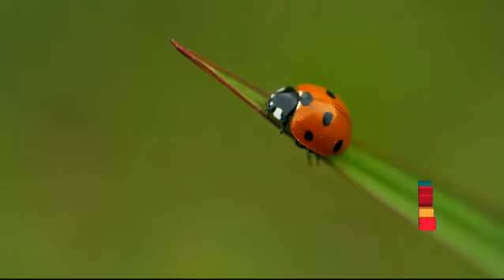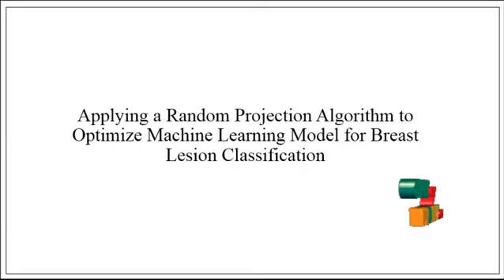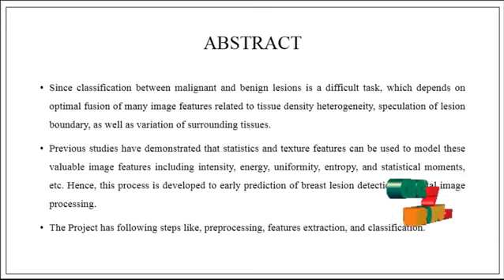Welcome to ClickMyProject.com. Now we are going to discuss the project applying a random projection algorithm to optimize the machine learning model for breast lesion classification. Now we are going to discuss the abstract of the process.